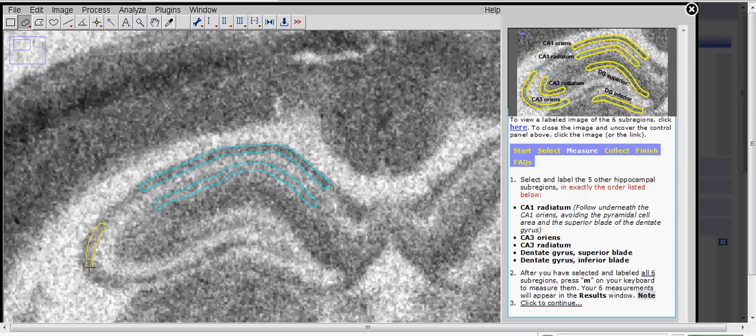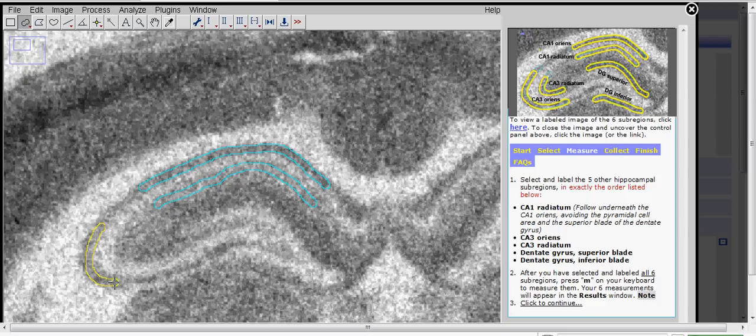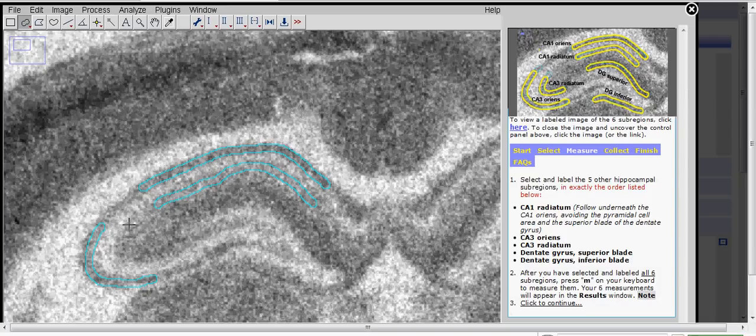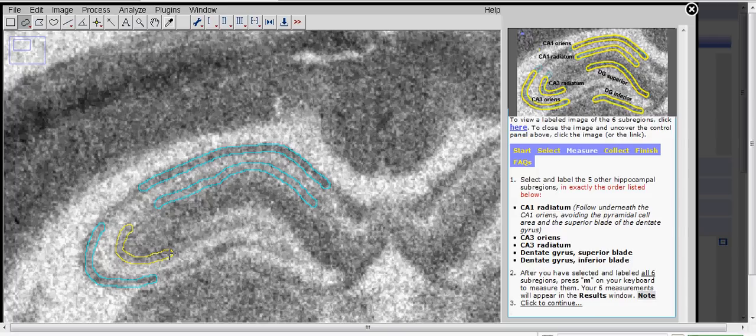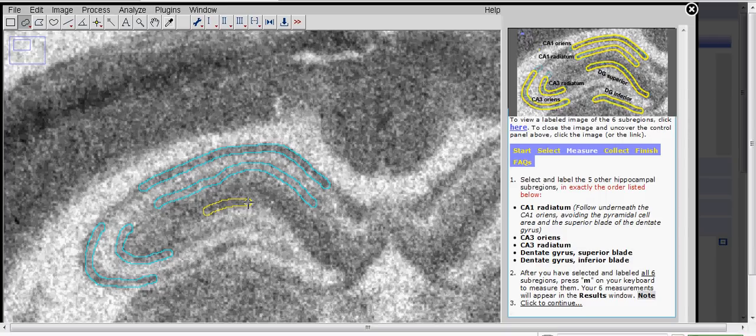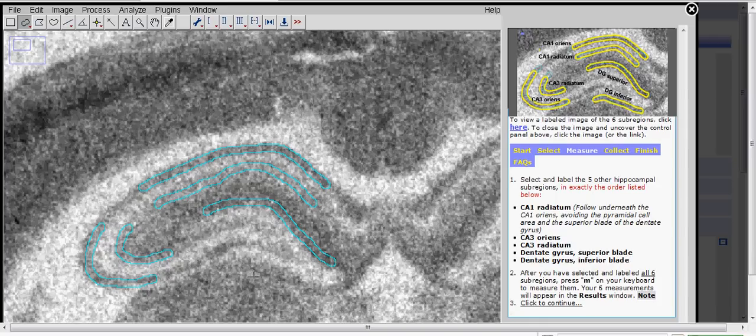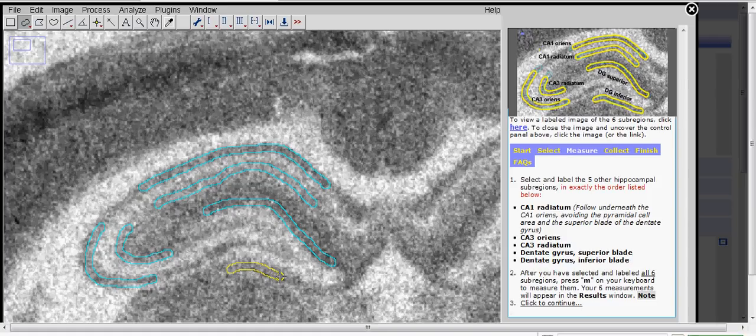Then the CA3 Radiatum. The dentate gyrus superior blade. And last the inferior blade. Now we have all six regions labeled and they're ready to be measured.